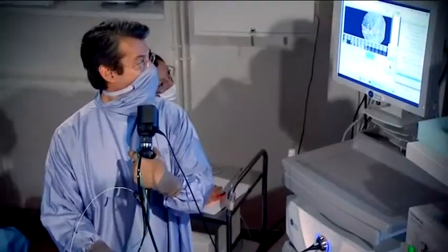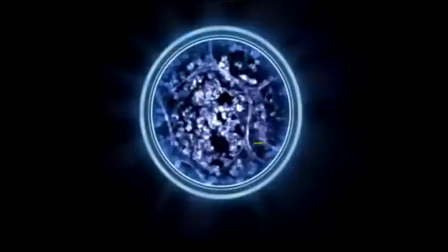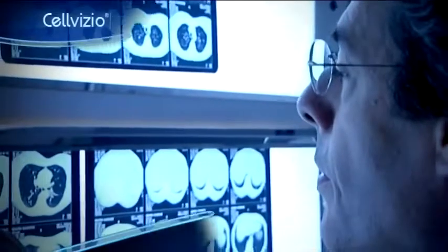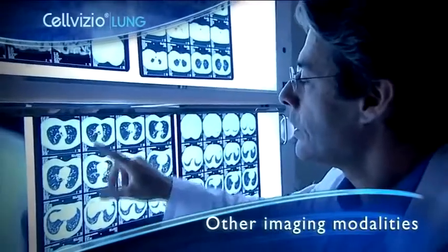Cellvizio Lung enables doctors to safely reach distal areas in the lung. It produces reliable, ultra-high resolution images of the alveoli as it lives and breathes. Of the imaging modalities currently available, none can produce live microscopic images of the alveoli in real time.